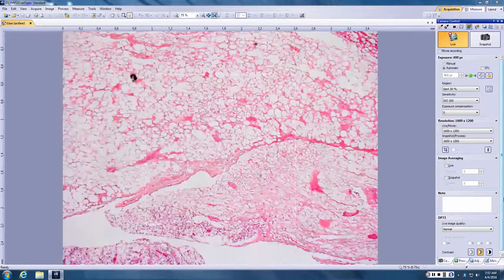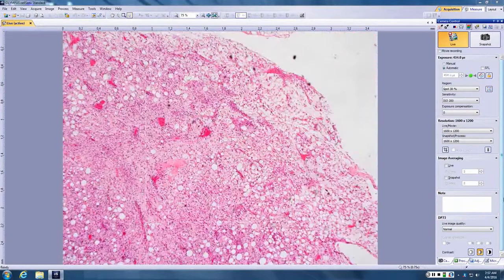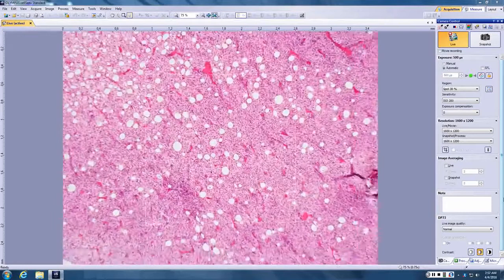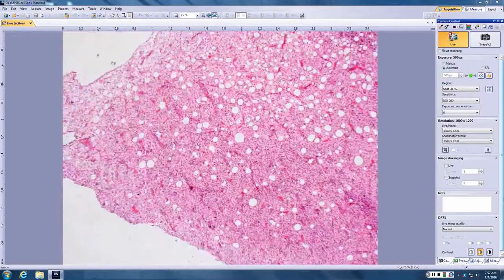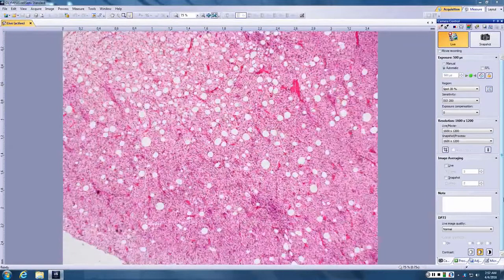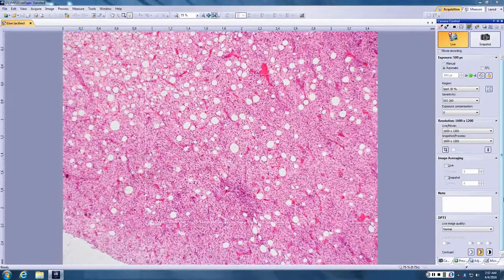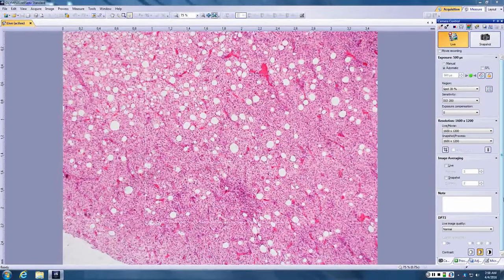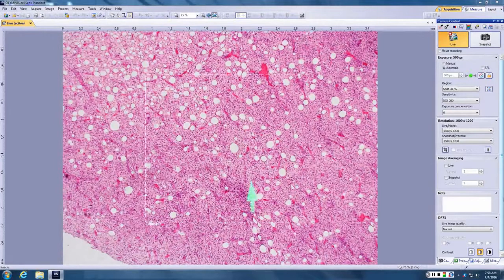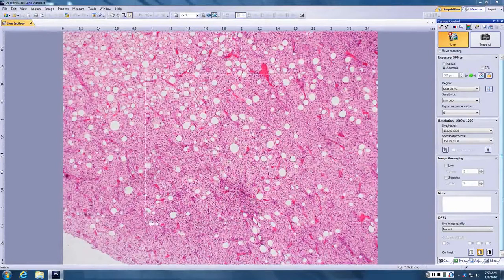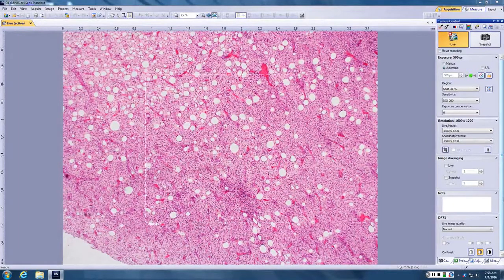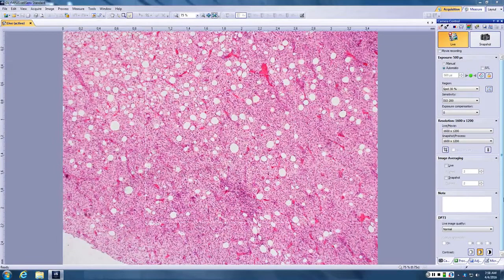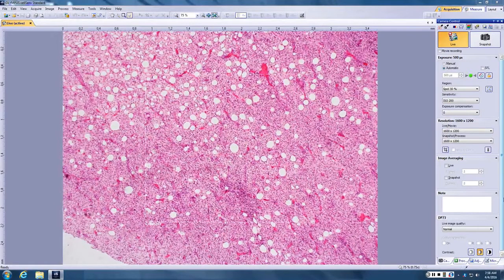That's exactly what one would call it. And the leiomyomas as a group are often spontaneously painful because they cramp up, right? So it's a muscle capable of cramping. Okay, so looks like a lot of cellularity with kind of fat in between, there's bursting vessels there as well. A lot of cellularity and a lot of vessels. And what descriptions might you use for those vessels? So all kinds of names have been used for these, crow's foot vessels, chicken wire vascular patterns. See how they kind of anastomose and they kind of branch out? So chicken wire, chicken footprints in a dusty yard, all of those terms. Most of us have experienced chicken footprints in a dusty yard, thank you. So city folk.